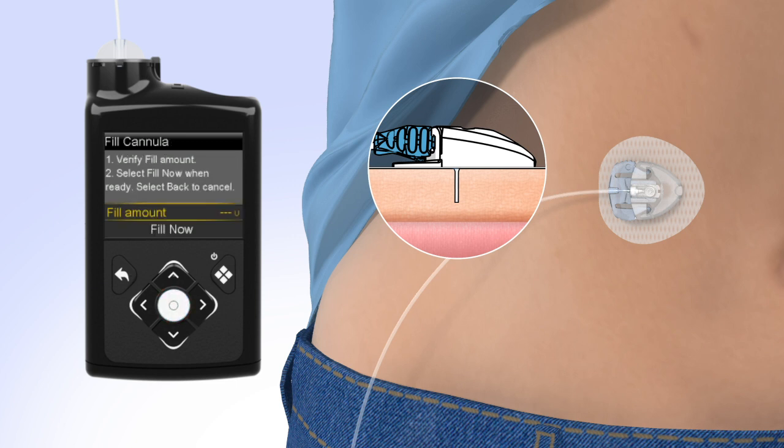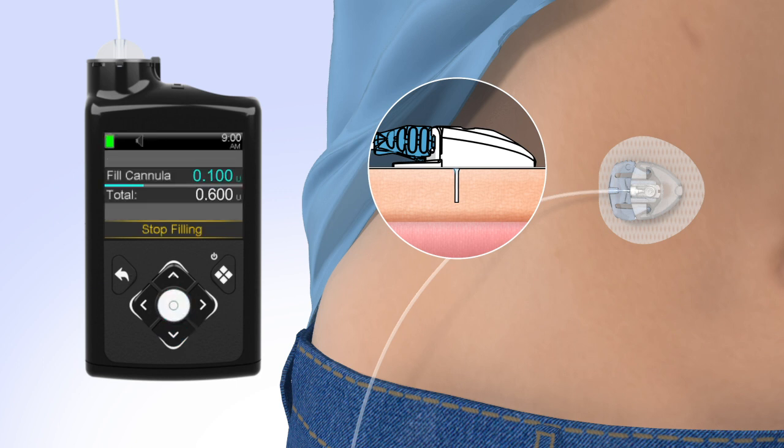The Fill cannula screen will appear with either dashes or the amount you previously used. The cannula requires 0.6 units of insulin to fill. To change the fill amount, press Select and use the arrows to scroll to the amount needed and press Select again. If the amount is correct, press Down to Fill Now, then press Select. The home screen will display the insulin as it fills the cannula.